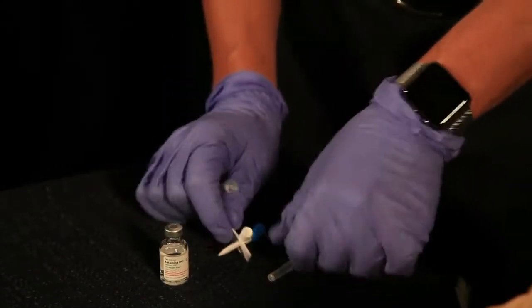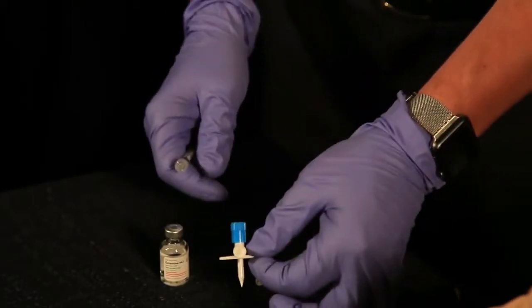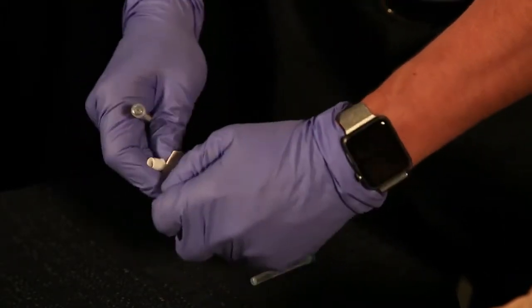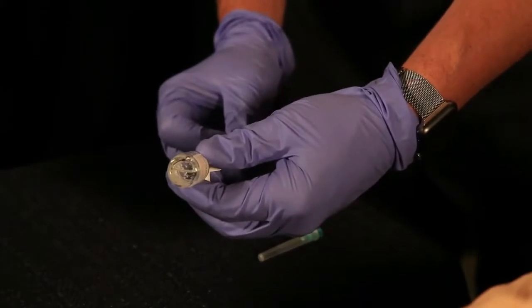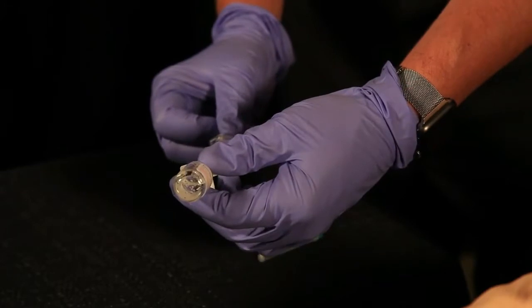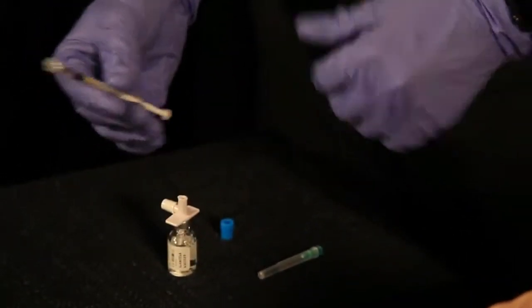There's a couple different ways of doing it. You could use the needle to pull it out of the vial, or you could use the mini spike and make this a needleless operation. So I'm going to go ahead and demonstrate it with the actual mini spike. And again, I said that we're going to pull up 0.25 mLs, which equals 25 milligrams. Then you have 25 milligrams, and now we need to dilute that.